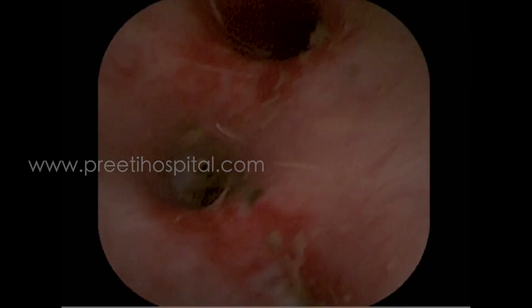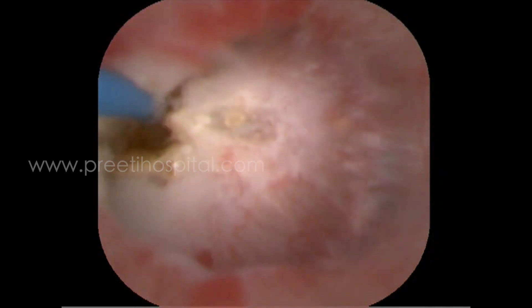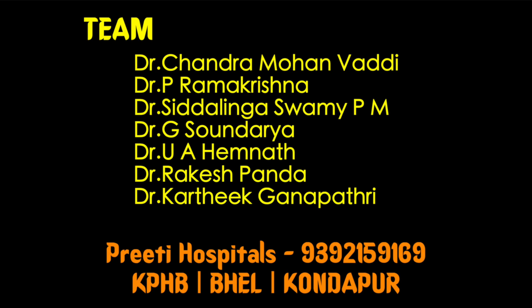My message is: sometimes when the entire ureter is nice but one area you are struggling because of the obliquity, you can still do primary RIRS. Our technique of visual obturator with the ureteroscope is very good. See, this is the powder and small fragments at the end which we might have left inside — with experience we can try these things. But if the ureter is not adequate entirely, you cannot do this type of surgery. Even primary RIRS or normal sheath insertion may not be possible — this problem is only at the ureteric orifice. Thank you.